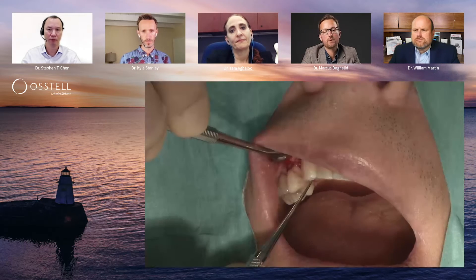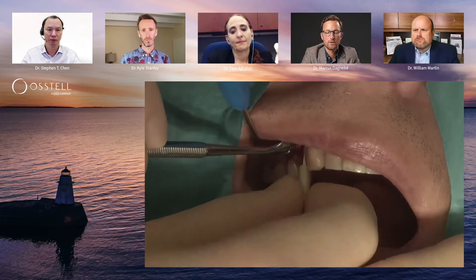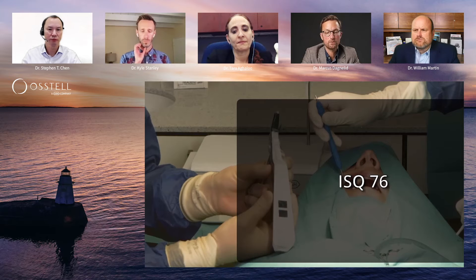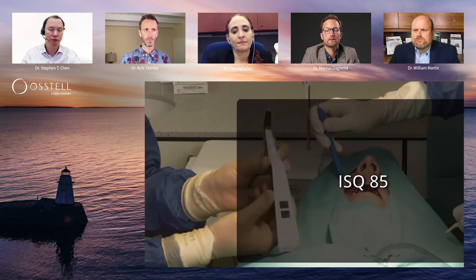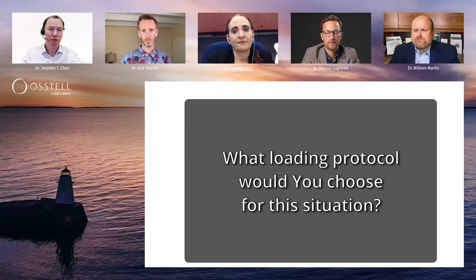We are also going to measure the stability of the implant by means of RFA and the Osstell technique. We attach the SmartPeg and measure the ISQ values in two different directions: the first is 76 and the second value is 85 — fairly high numbers for a maxilla case.